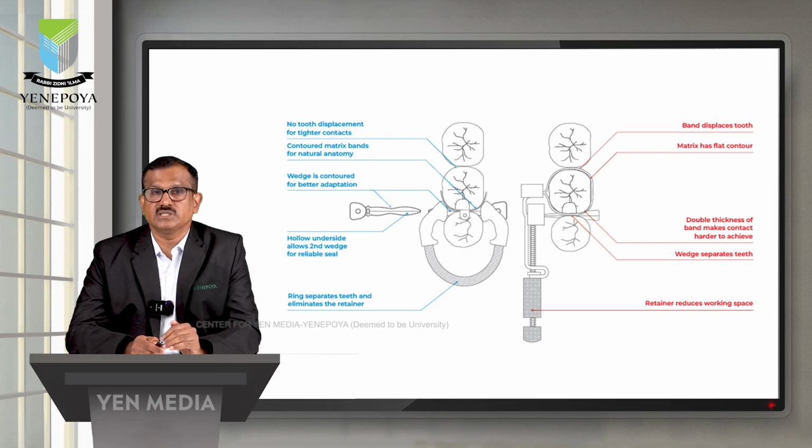So what we have to achieve initially is separation, so that physiological tooth movement takes place and a separation happens in between, and then the wedge and the matrix are placed in between. That is the reason ring separators, or G rings as company people call them, are provided along with the sectional matrix system. Palodent V4 is the latest which is widely used, Polydentia too, so many companies have got that, but they are among the most popular.